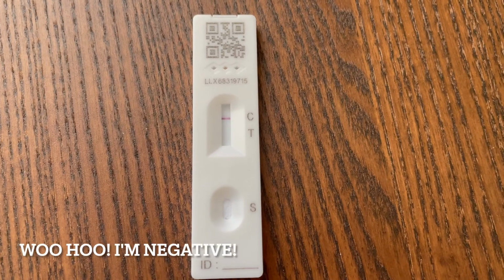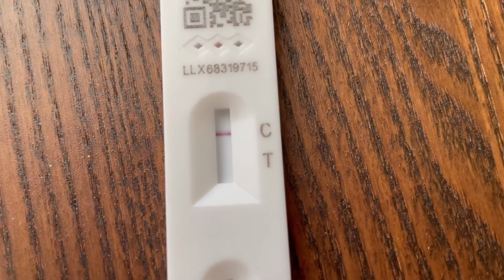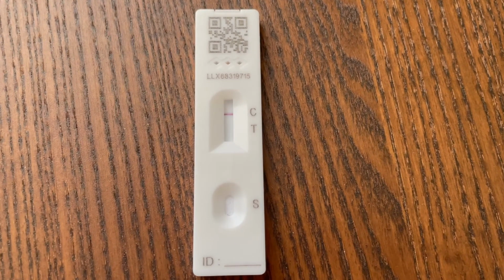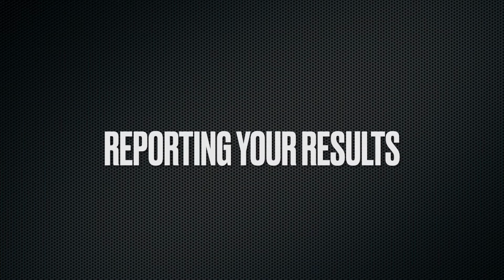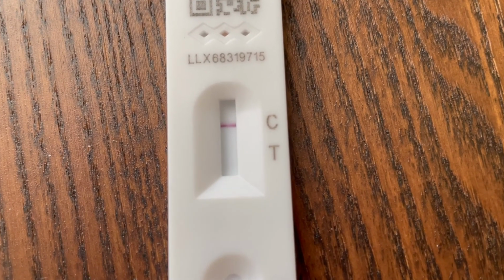If you get a negative result, it is likely that you were not infectious at the time the test was taken. If you test negative, you must continue to follow the national and the local rules and the guidelines, including regular hand washing, social distancing, and wearing face coverings when required. You can report your result online, and that is the fastest way, or you can report by telephone. You need the QR code or the ID number under it on the test strip to report your result.